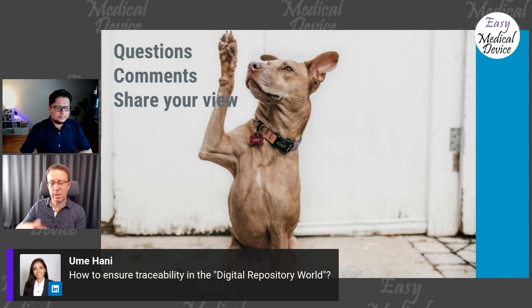So a common way to do this in the repository world, for example, if you work on a requirement: very often you have what you call a main. And when you develop software, you do a branch, and from that branch you work. And when you're ready with it, you merge it back to the main again.